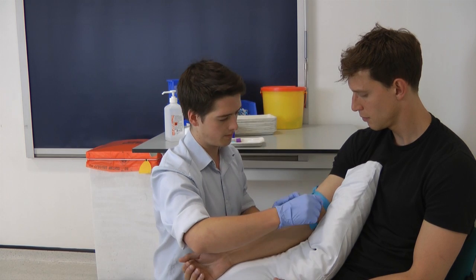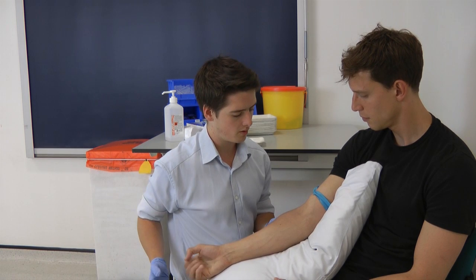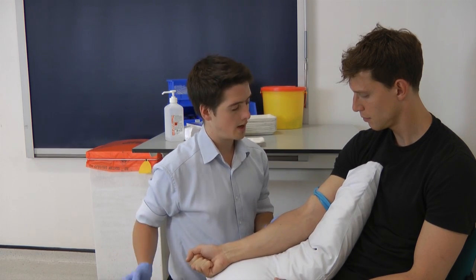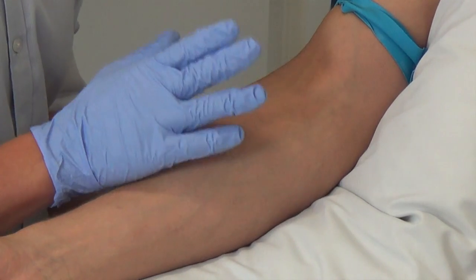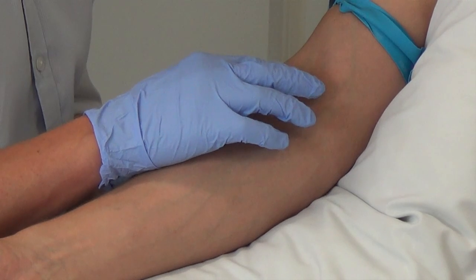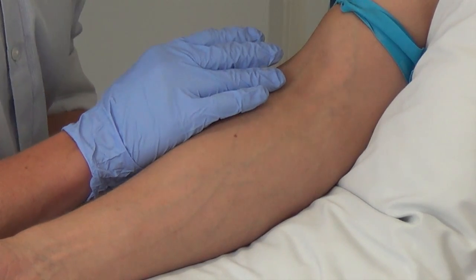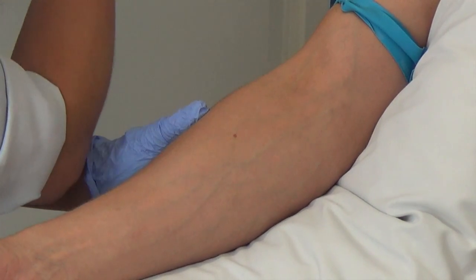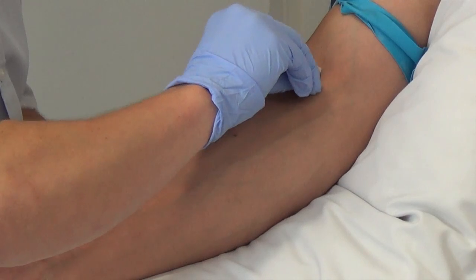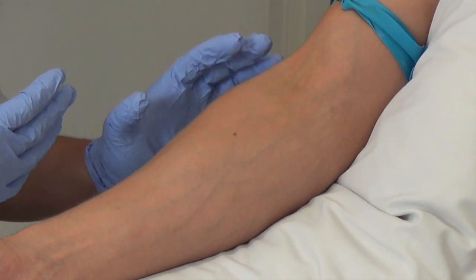If you just rest your arm down. Would I be able to just get you to make a fist with your hand for me and just pump like that? That's perfect. It's important to have a look for veins but also to feel the veins to see if they rise from the surface, as they'll seem more likely to be successful. So I can see and feel a very nice vein here in the antecubital fossa. So I'm just going to clean with some alcohol — a single clean, making sure you don't go over the same area. I'm going to leave that for approximately 30 seconds.